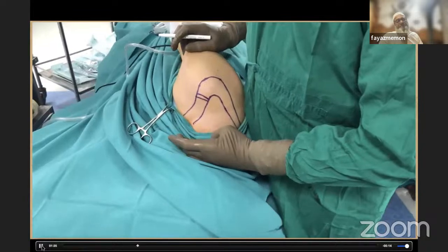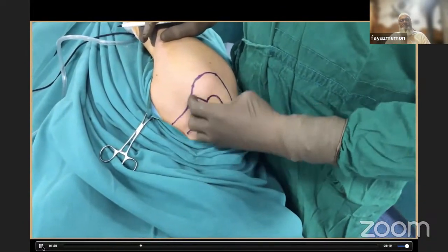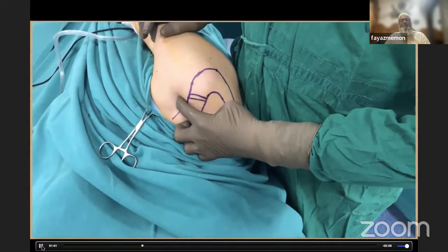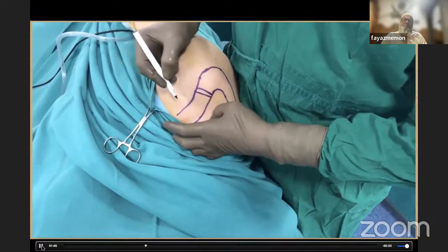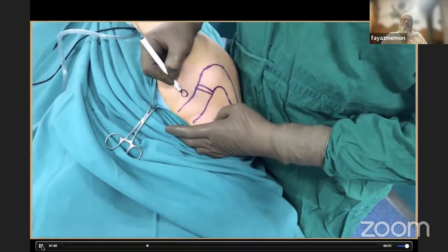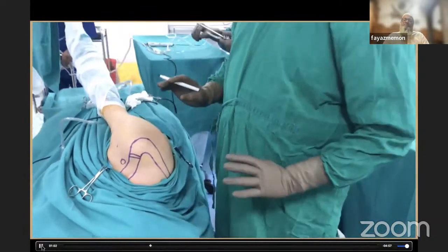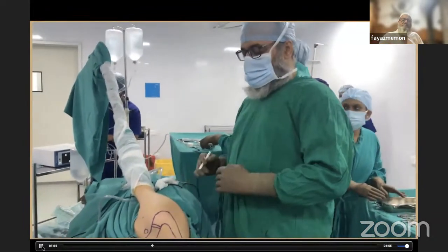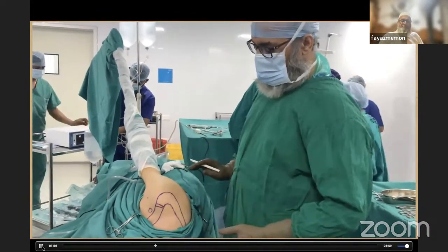Then the second thing that you do is, in the maximum concavity of the clavicle, you just try and palpate. Here there is a bony prominence, and that is nothing but the coracoid process. Now, depending upon what surgery you are doing, you are going to mark your portals, whether it is intra-articular or the subacromial. Okay, I will show you the intra-articular portals first.